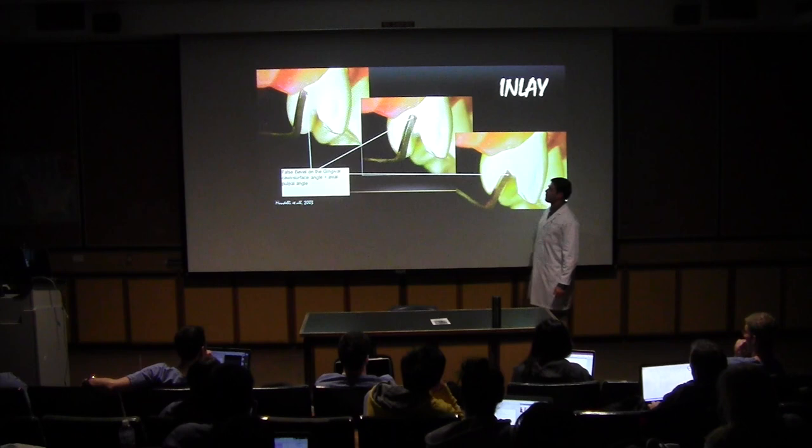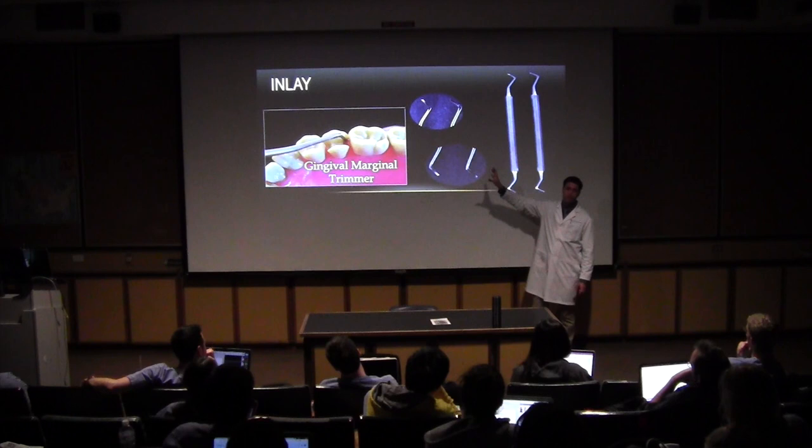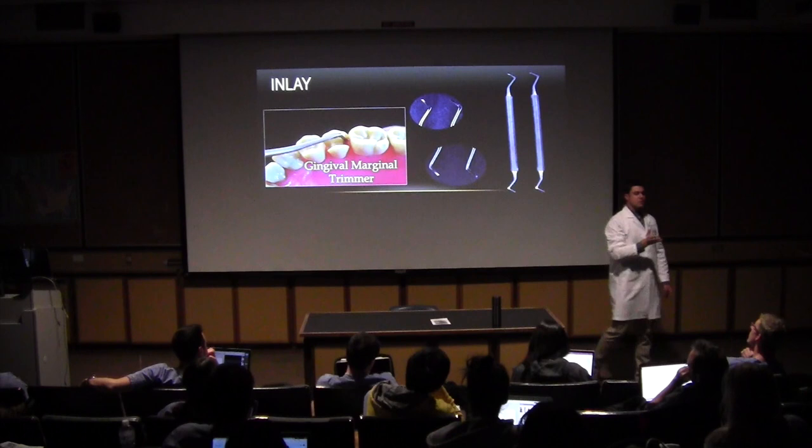So remember to use the correct gingival marginal trimmer, depending on which side of the tooth you are working, if it's mesial or distal. And begin to work with the gingival marginal trimmer from the center. All right? Always begin from the center towards the buccal or lingual, depending on the direction you are working.